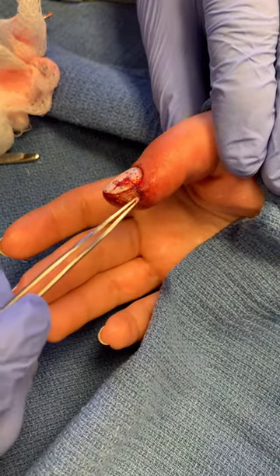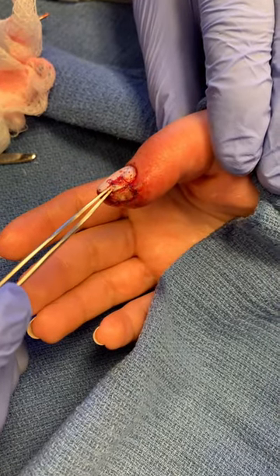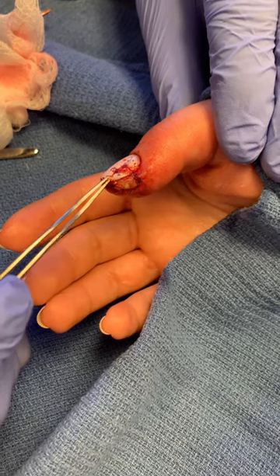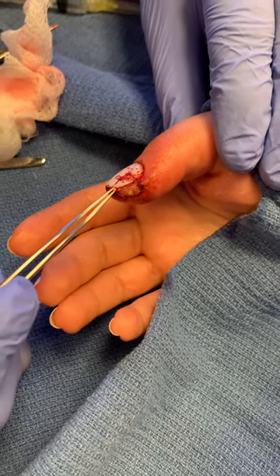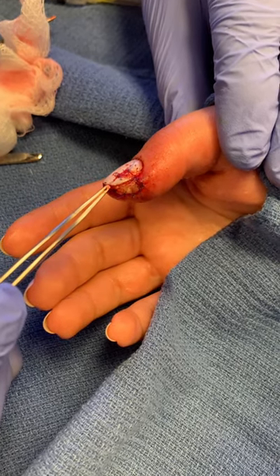So here we are. We sutured back the skin and the nail. Now the nail isn't, of course, going to take, but what it does — it allows the nail to maintain the nail bed and for it to continue coming out straight.